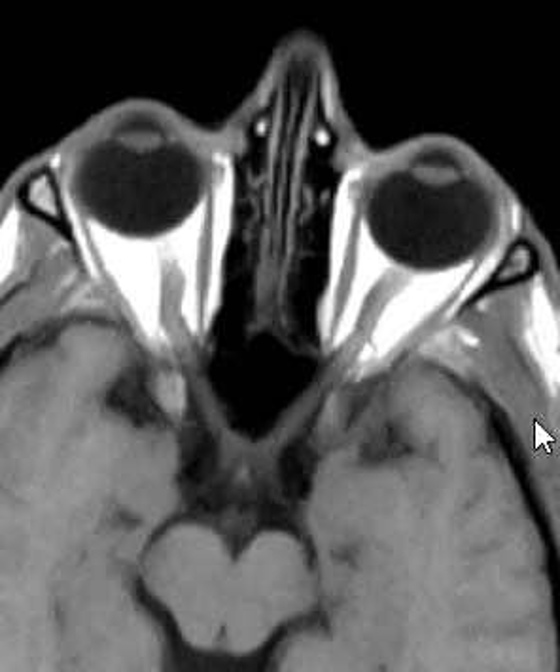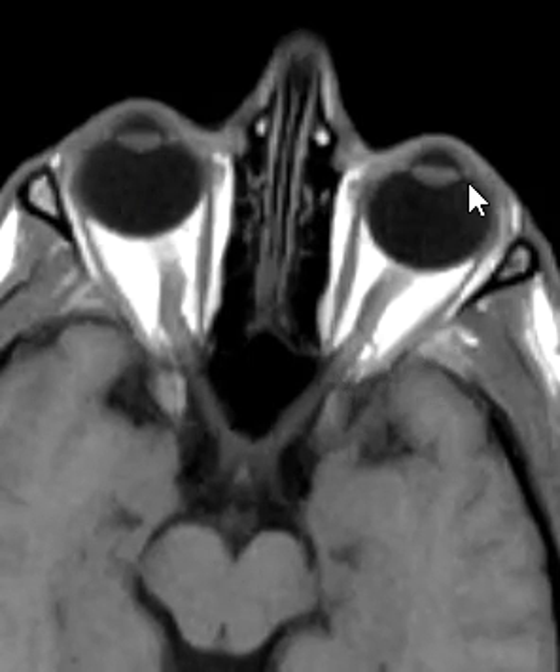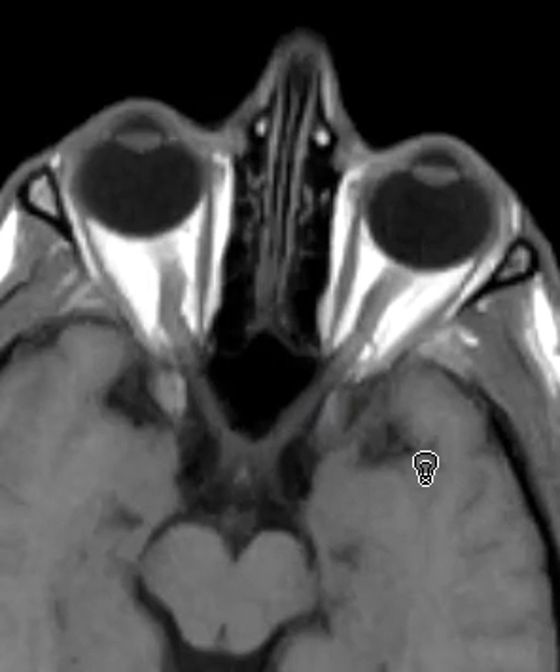Hello, this is Dr. Gay. I just happened to see this nice case where I can see the optic nerves on one slice. Usually when we take images we have a slightly different angle and we don't see the optic nerves all in the same slice — you have to look at two or three slices — but here we just happened to catch this left one all in one slice. So it's interesting to see this anatomy.